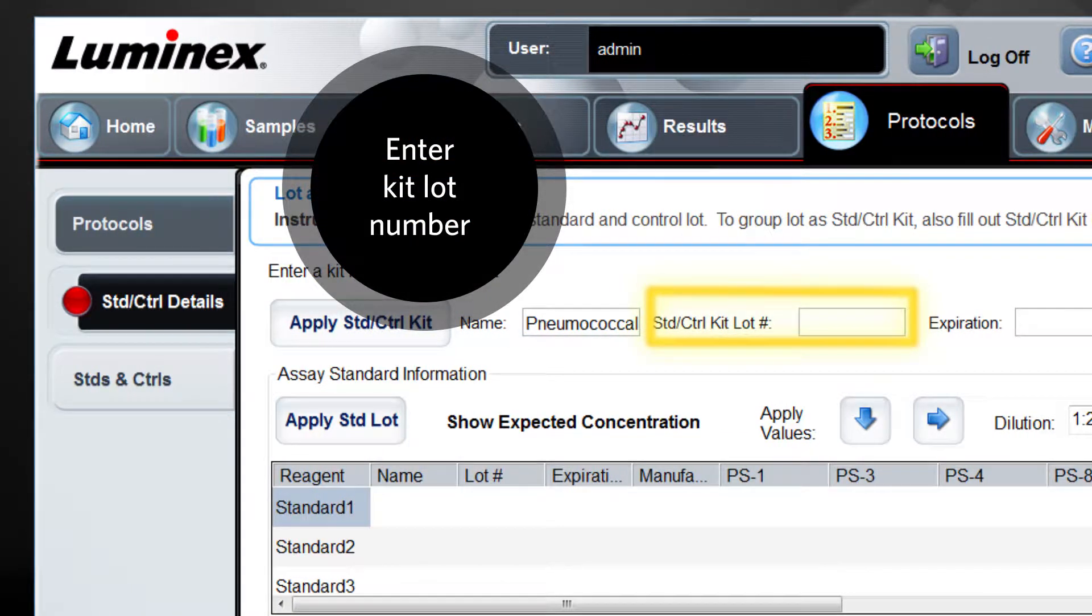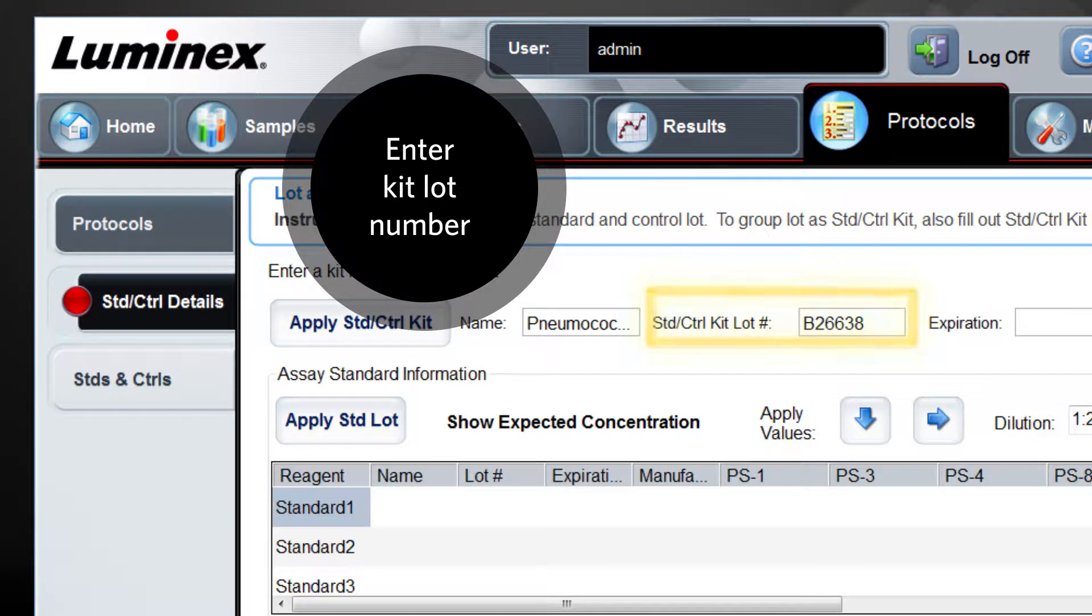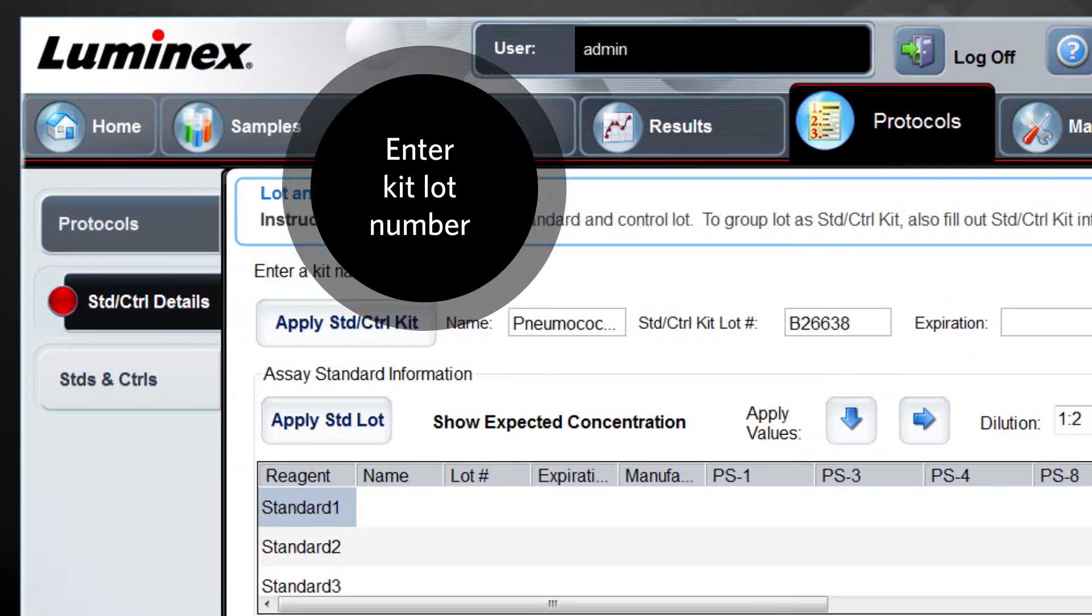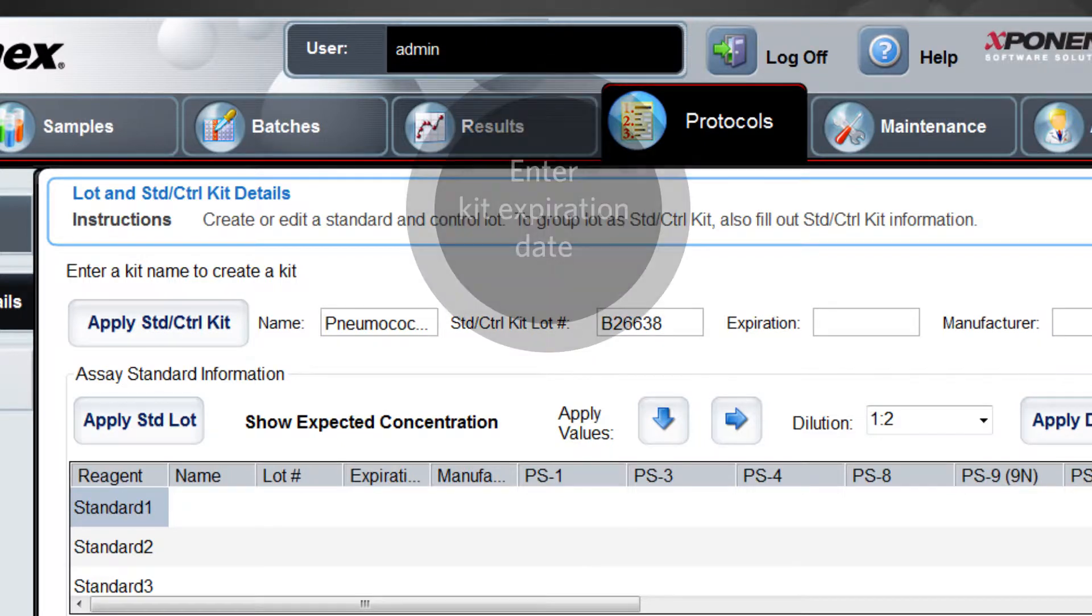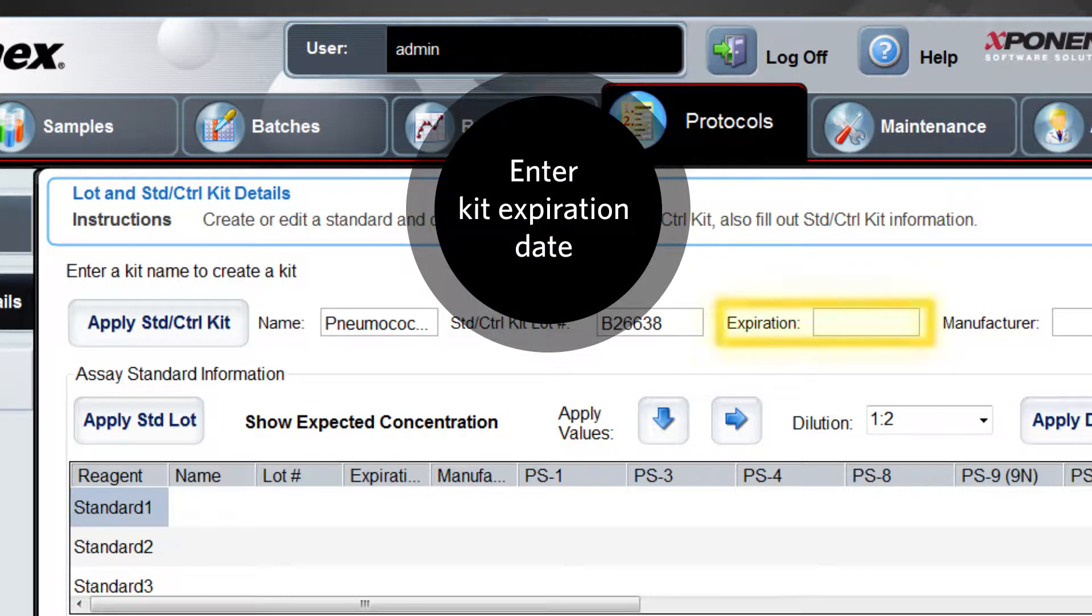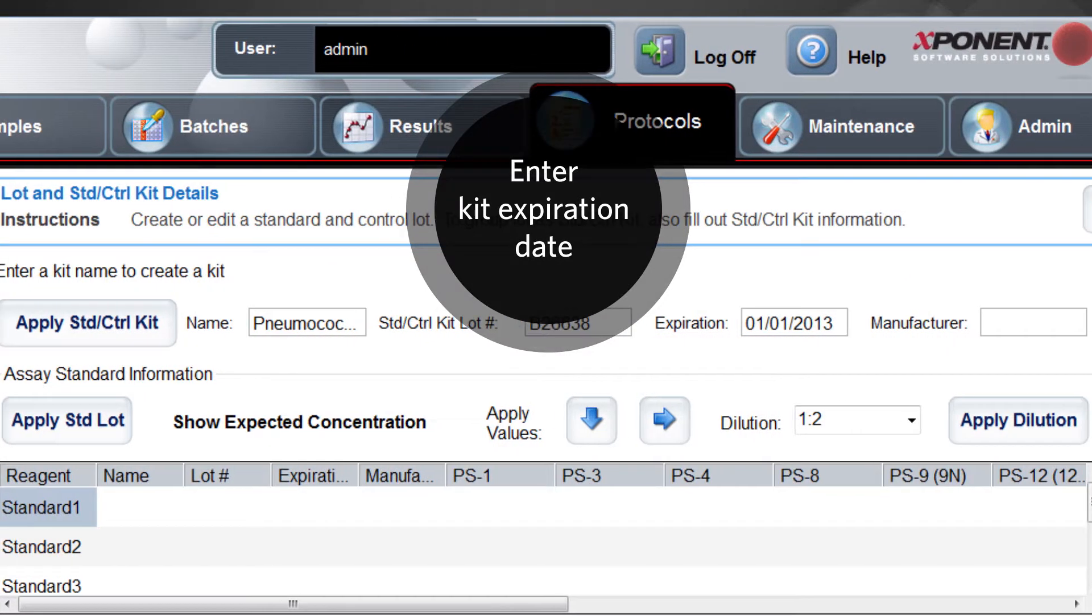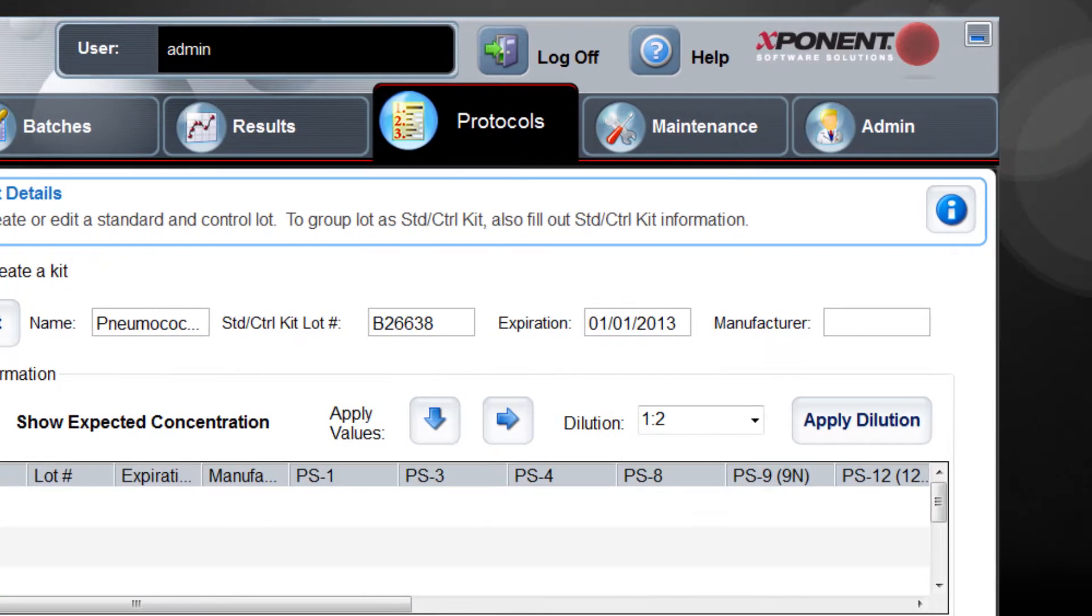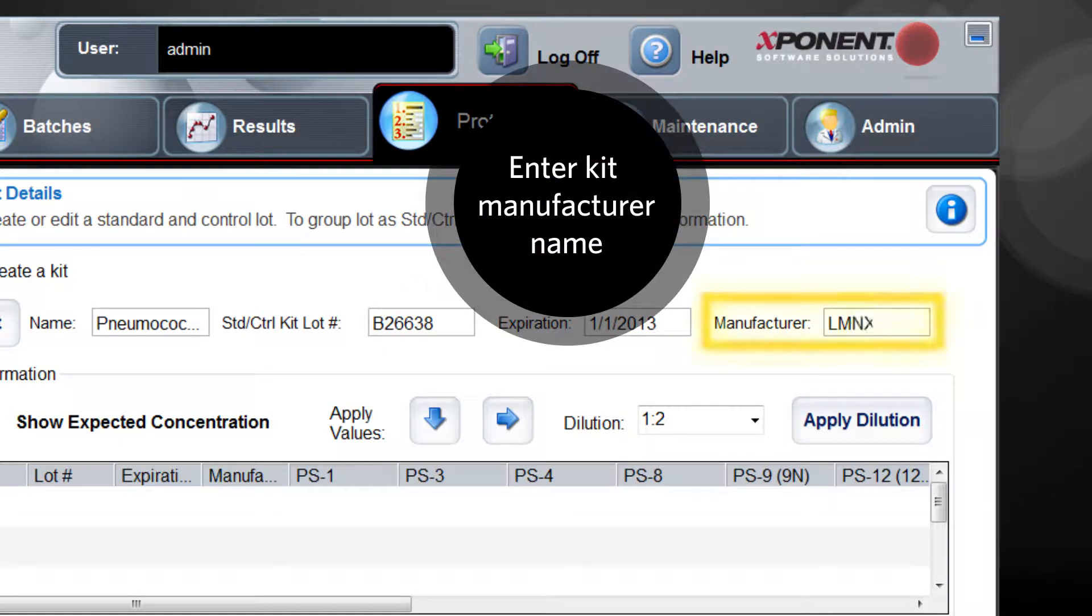Then, in the standard control kit lot number box, enter the kit lot number. In the expiration box, enter the expiration date using the double-digit month, double-digit day, and four-digit year format. And finally, in the manufacturer box, enter the manufacturer name.